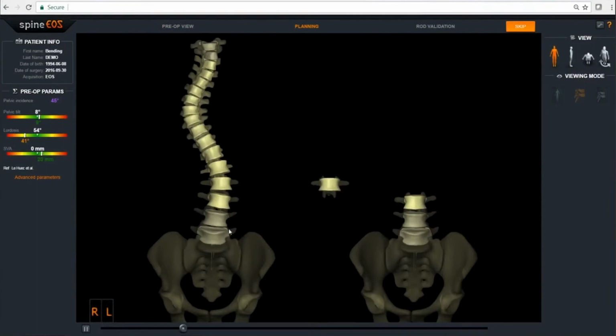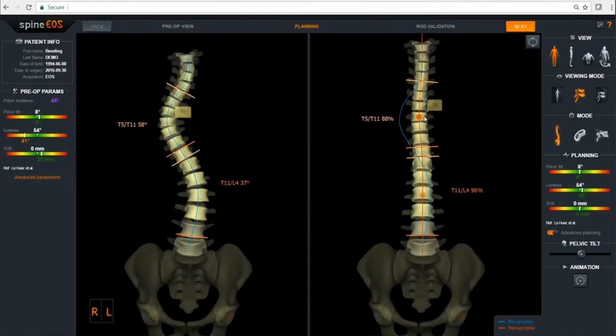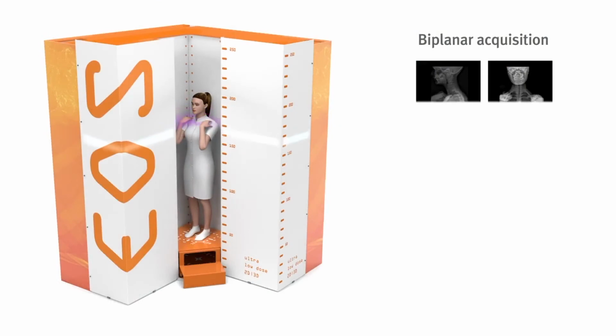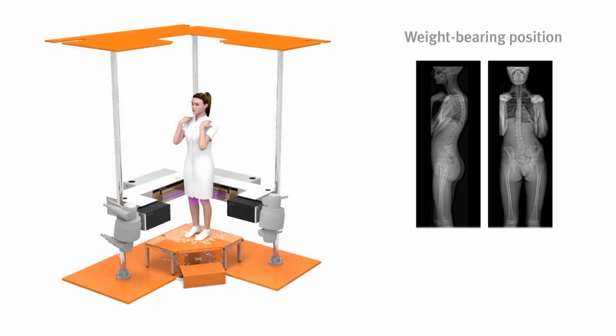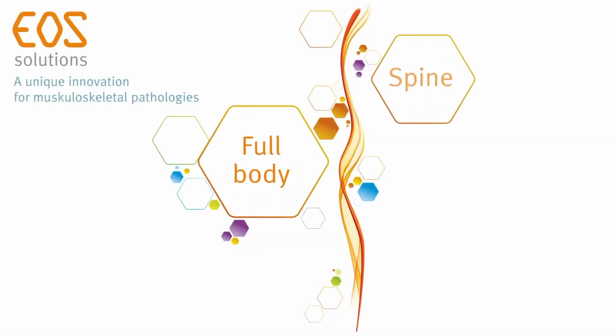What was important to us was to understand from the clinicians what else you could do, really why it was better. We understand that it's lower radiation, and so that's advantageous to the patient. But are there other advantages too? And so what we found was it's faster. So think it's more efficient. We could do more scans. Patients are happier. You could do a full scan in 3 minutes that might take you 12 minutes with a traditional X-ray machine. And so think from a reimbursement standpoint, you could do more codes in less time.